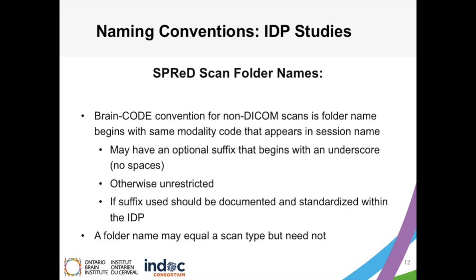Naming conventions for SPReD scan folder names within IDP studies. The BrainCode convention for non-DICOM scans is folder name beginning with the same modality code that appears in the session name. It may have an optional suffix beginning with an underscore and not containing spaces.